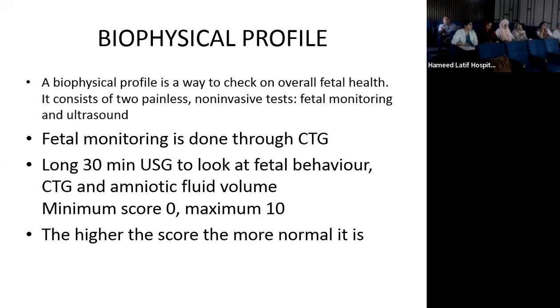And while you're doing an ARM, somebody looks at the monitor and traces it. For how many minutes? 5 to 10 minutes. No, not the PV. 30 seconds. 25 to 30 seconds.